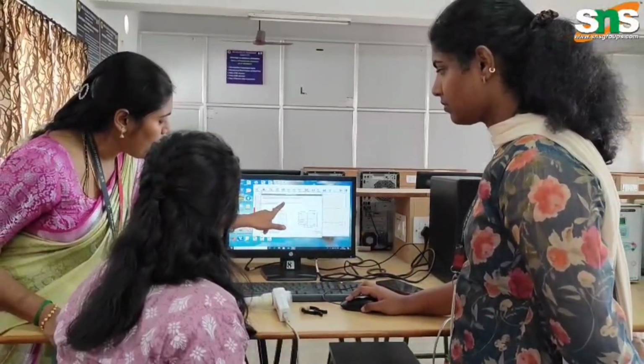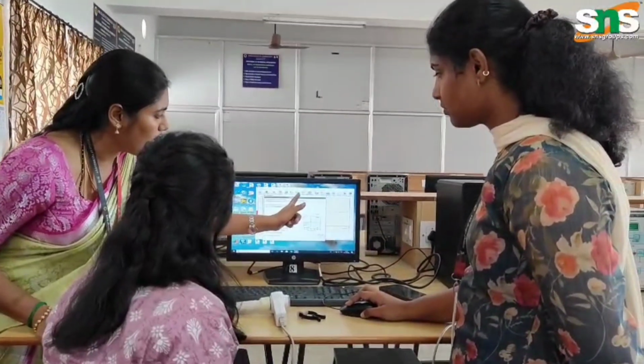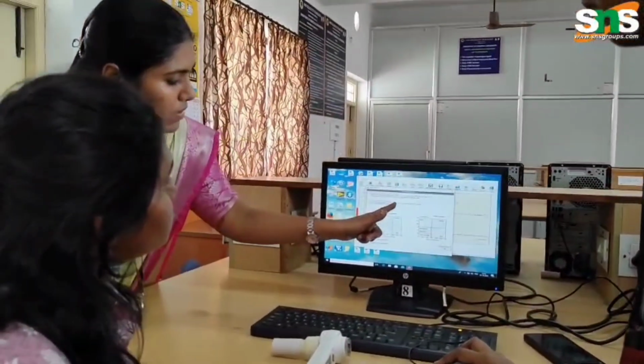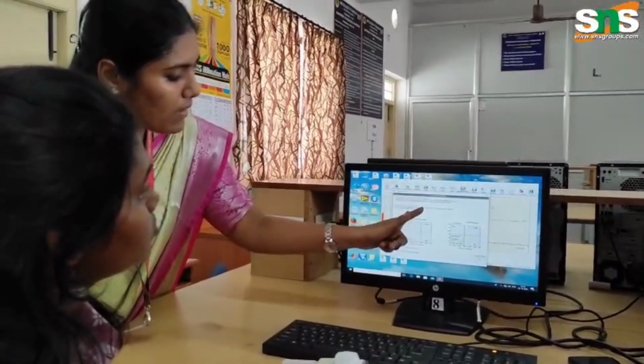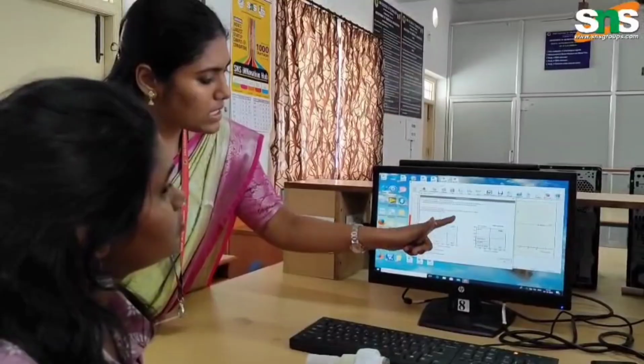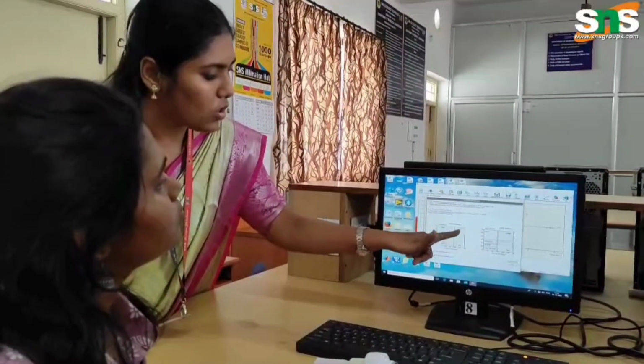These values we can get from the previous test. After substituting all the values in this formula, if you get a value less than 70%, it is considered COPD. If it is above 70%, the person is normal.